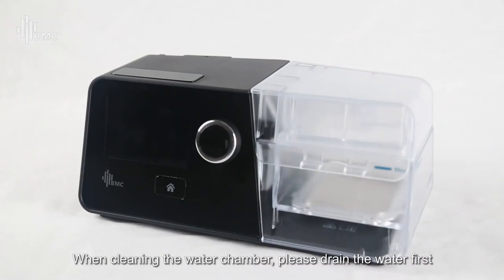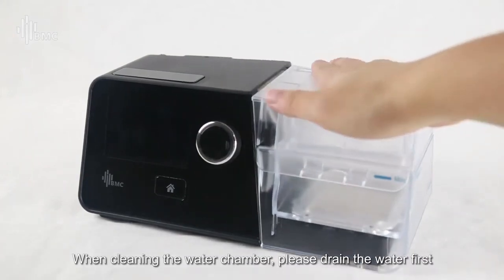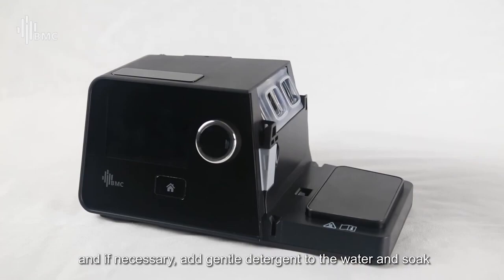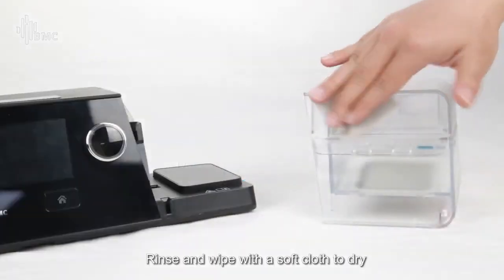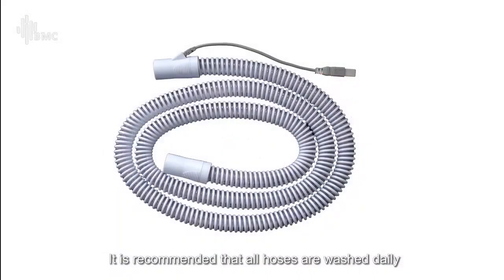When cleaning the water chamber, please drain the water first. Wash with tap water and, if necessary, add gentle detergent to the water and soak. Rinse and wipe with a soft cloth to dry. It is recommended that all hoses are washed daily to prevent germ buildup. Wash with mild detergent and water, and allow to air dry.